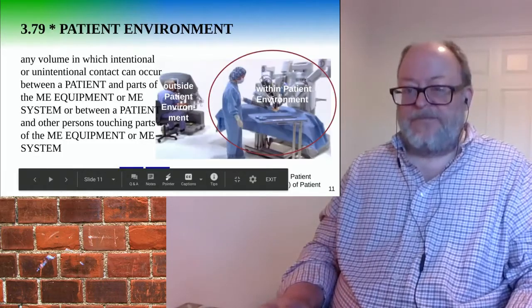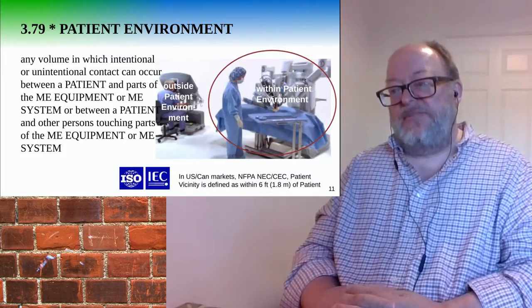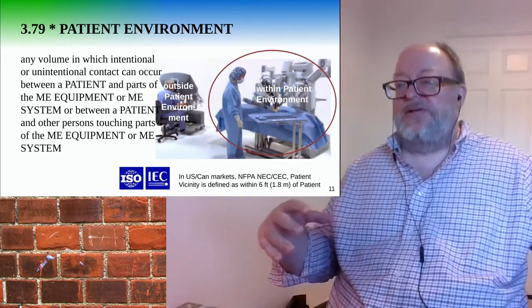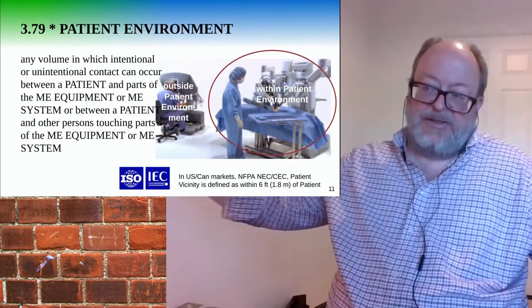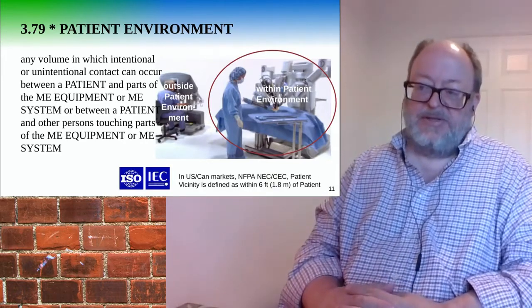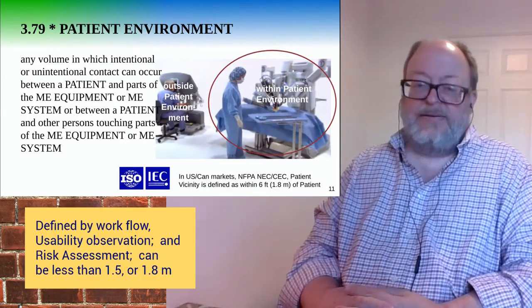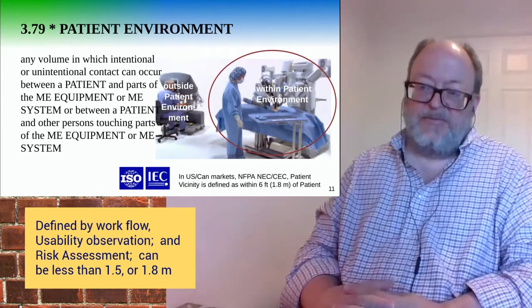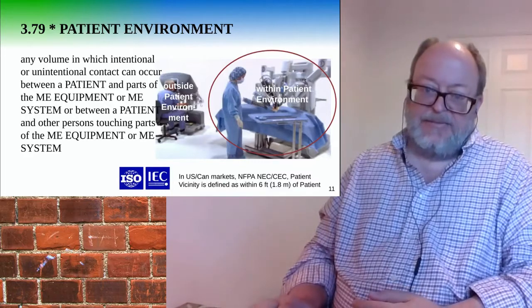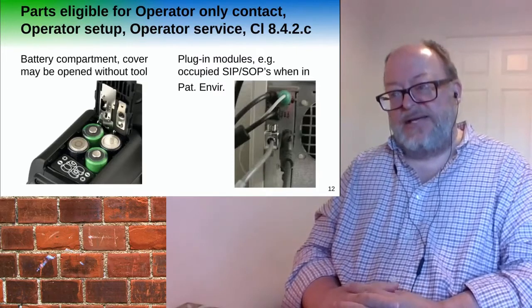Patient environment. That's the formal word for the environment in which the patient can touch the medical equipment, as well as the operator may be touching the equipment and being able to touch the patient. So it's a slightly bigger area than just a patient's reach. Within that environment, we assume all medical electrical equipment resides. But there is a special case where we allow operator-only contact.